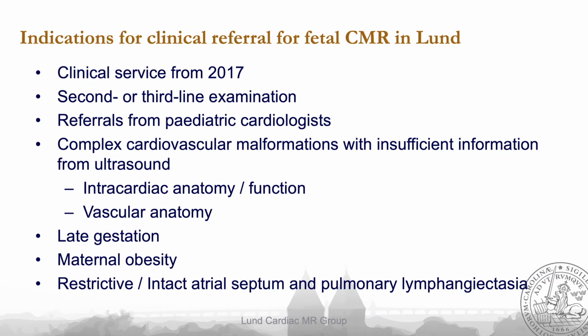So we have a different setup compared to King's, where David started out talking about their vascular perspective, whereas we have more of a cardiac perspective. So our referrals are on complex cardiovascular malformations, where there is insufficient information from ultrasound, usually questions about intracardiac anatomy and function, and commonly, but less importantly, the vascular anatomy.